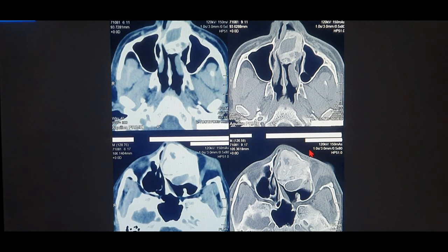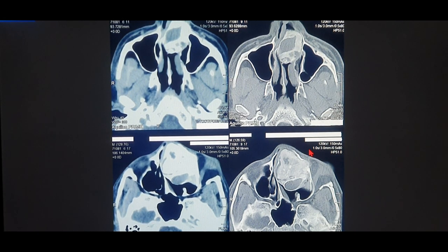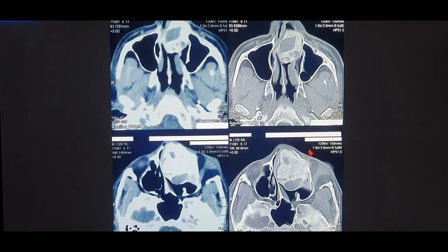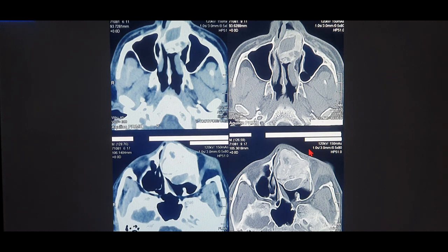Hello, this is Dr. Jinka here. In this video today, I'm going to teach you a simple concept of how you can differentiate between a soft tissue window and a bony window on a given CT scan. I've been getting a lot of questions - many young surgeons and juniors have difficulty identifying a soft tissue window from a bony window.